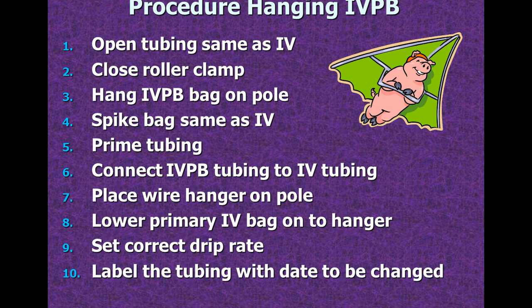If using an IV pump, set secondary volume and rate. Primary IV will start to run when IV piggyback is infused. Label the tubing with date to be changed.